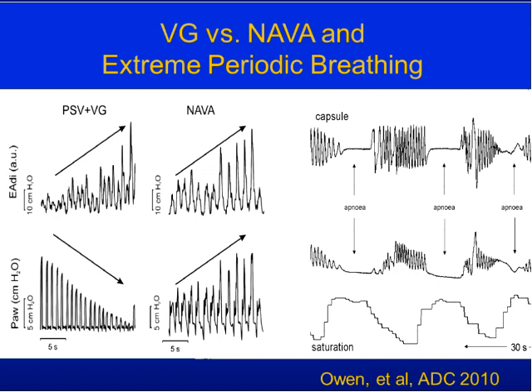You can see on the left-hand side there is very little effort, and therefore the pressure generated by the ventilator is high. The ventilator compensates for lack of effort to try to keep the tidal volume stable. As the baby breathes more and the tidal volume exceeds the target, the pressure will drop to avoid exceeding the target tidal volume. So that makes a lot of sense for premature babies who have a very irregular respiratory pattern, as seen on the right.